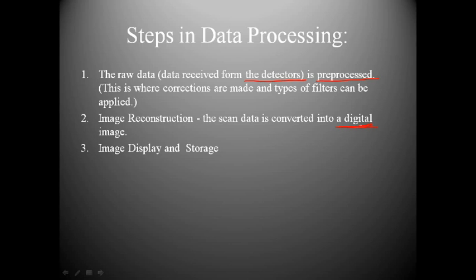So, it's important to remember that there's a difference between a digital image and basically an analog or a true type of image. The digital image is what you're going to see on monitors or PACS.